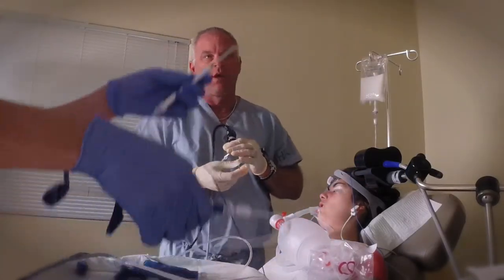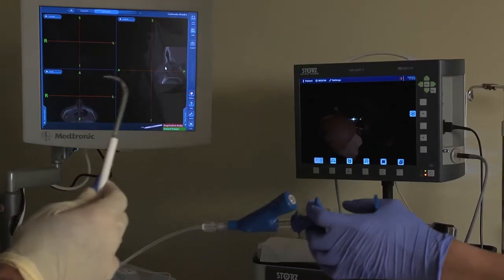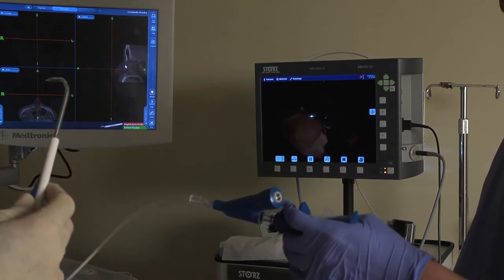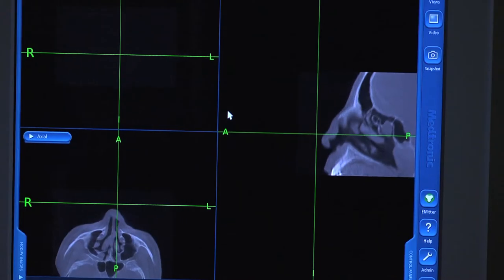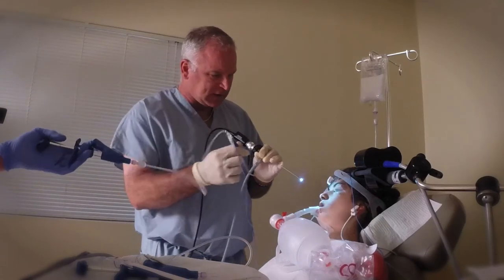Now for the balloon part. Here's the balloons. The first thing I want to do is make sure that the balloon is properly registered with the computer. So I'm going to check it to a visual point like the patient's nose. And I can look up on the computer screen and see that the green X's are right on the tip of the nose, which lets me know my accuracy is intact.